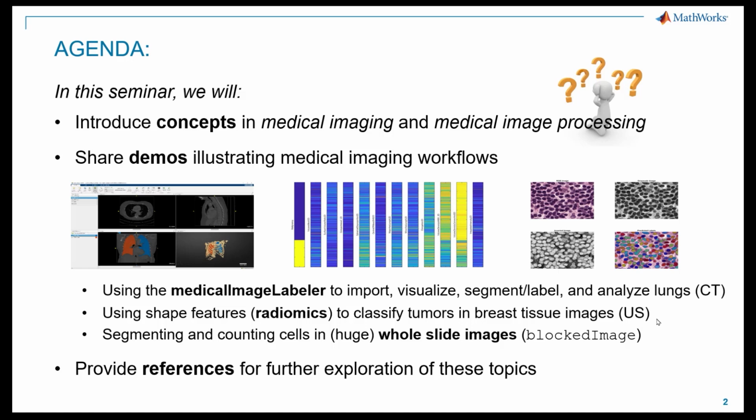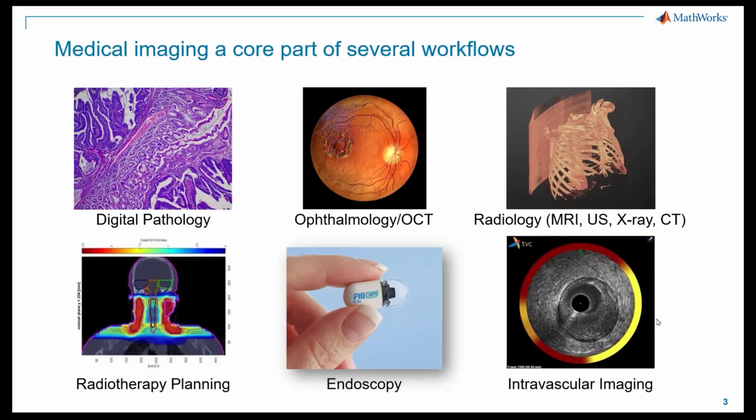I've got a lot of slides as I go through these presentations, and I'm not going to spend a lot of time on those slides, though. I'm going to go through them very, very quickly. But many of them have hyperlinks. I'm just going to give you those as tools that will allow you to explore these topics on your own time. What are people doing in the medical imaging workflows?